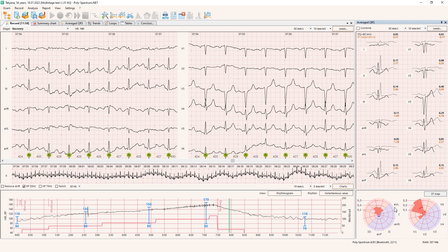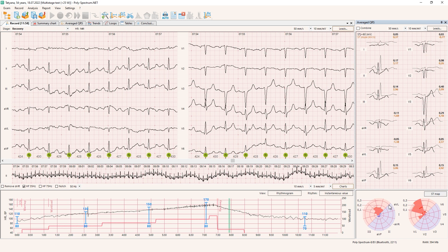There is also an ST map showing ST elevation and depression in a circular graphic. This view is convenient because the standard leads are depicted in Cabrera fashion, so anatomically adjacent leads appear nearby. When thinking about whether depression or elevation is in adjacent leads or not, in standard view you have to jump — for example lead I and then aVL or minus aVR. Here we see these leads nearby. The Cabrera convention unfortunately is not in use on standard ECG despite the recommendation to use this way of showing ECG.